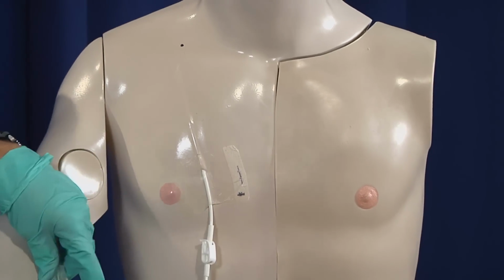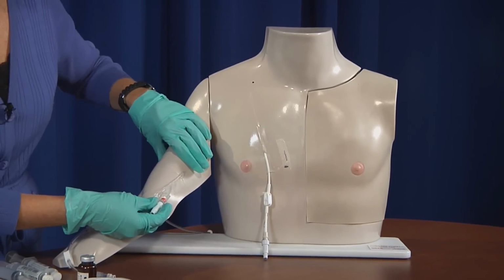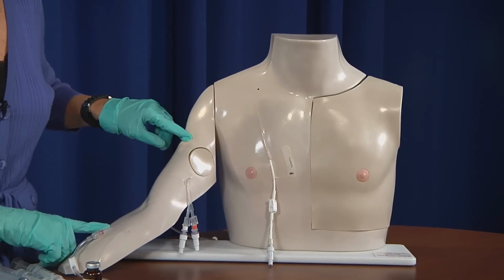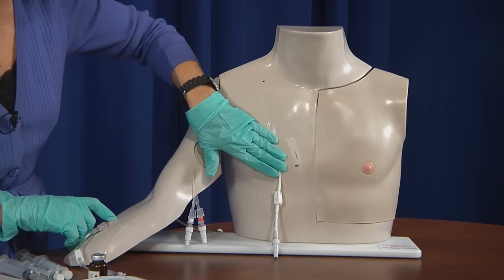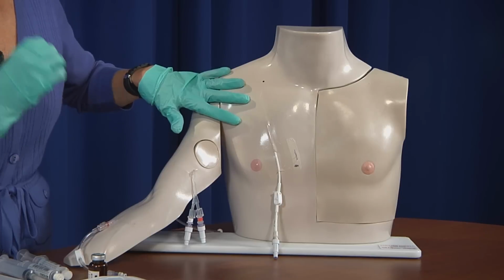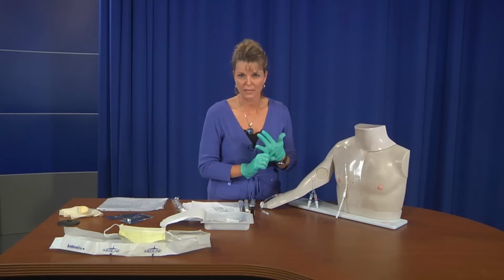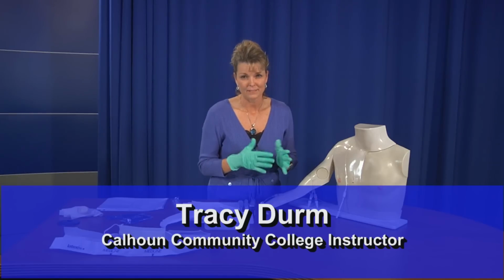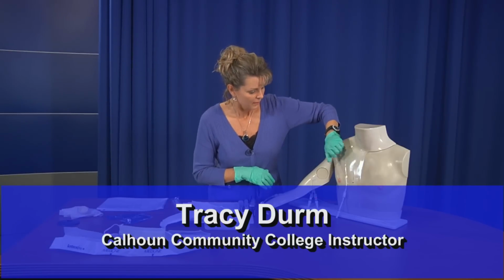This and this is called a PICC line. It's a peripherally inserted central venous line. Now, what they do is they find a really good vein, and they insert it under fluoroscopy in the x-ray department into that superior vena cava. And this is going there also. So basically, you have a line that goes into a very large vein. We can give lots through that line. High-powered medications, chemotherapy, TPN, all those things. So that's why we use those.